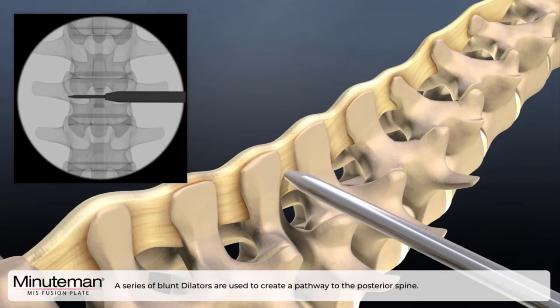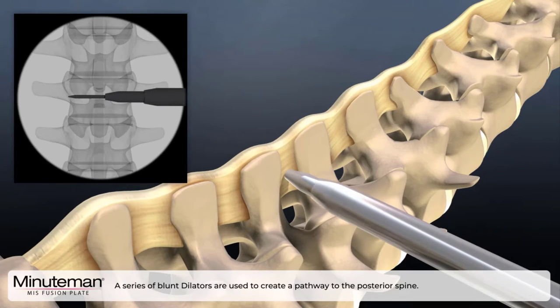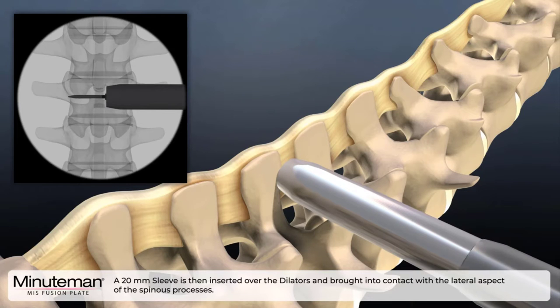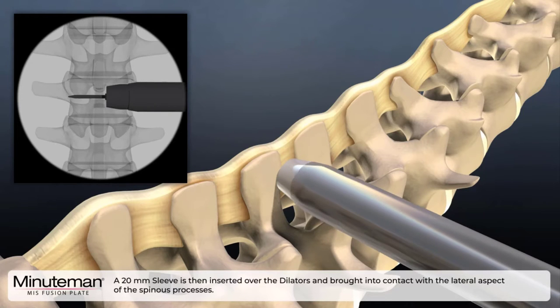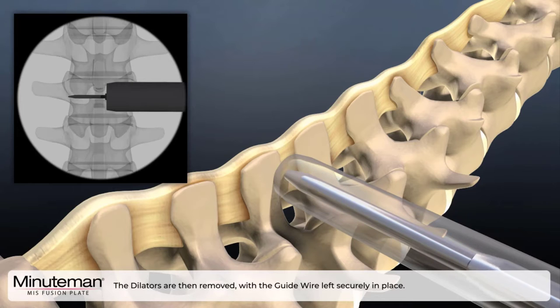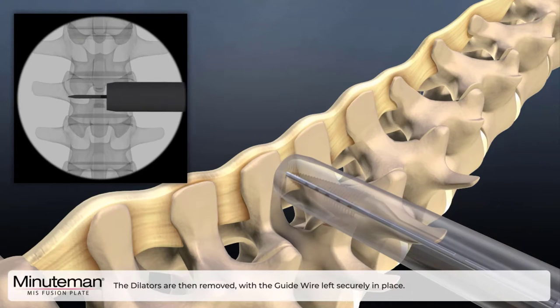A series of blunt dilators are used to create a pathway to the posterior spine. The 20 mm sleeve is then inserted over the dilators and brought into contact with the lateral aspect of the spinous process. The dilators are then removed with the guide wire left securely in place.